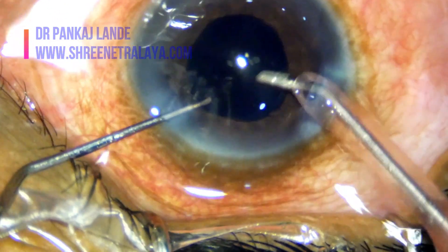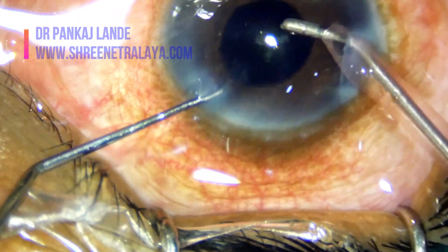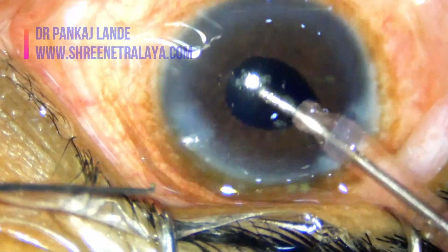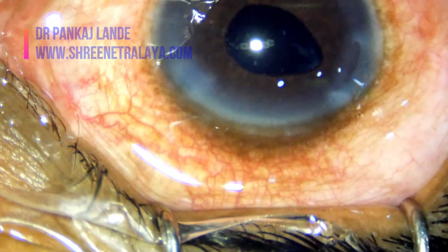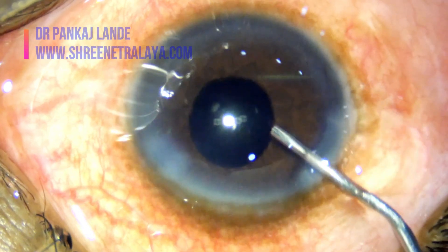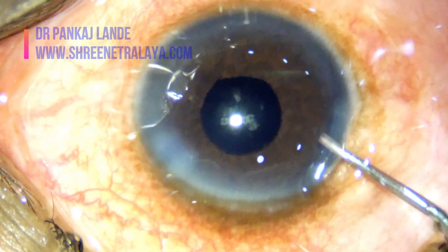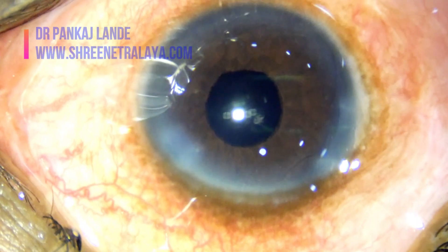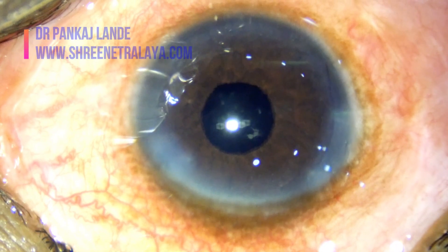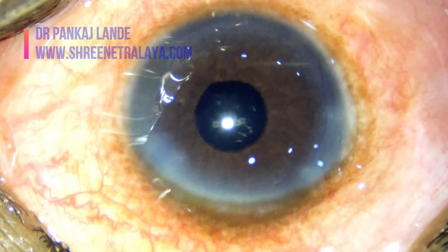Notice intraoperative miosis of the pupil while performing IA. I have left some amount of cortical material behind. I am still proceeding with implantation of the IOL as removing these last fibers can cause PC rupture at any moment. I want to first safeguard my posterior capsule with the IOL and then remove the residual cortical material.